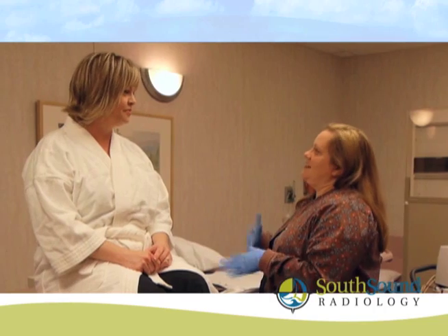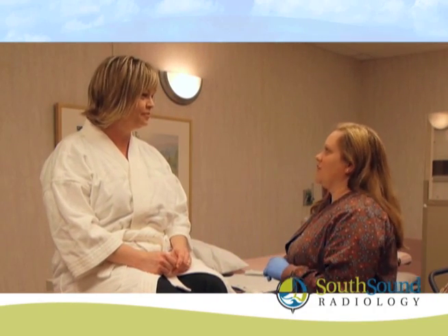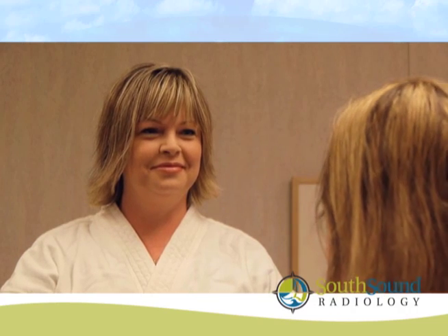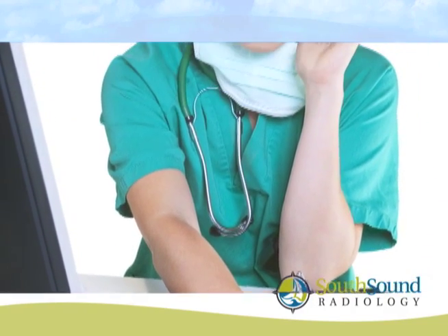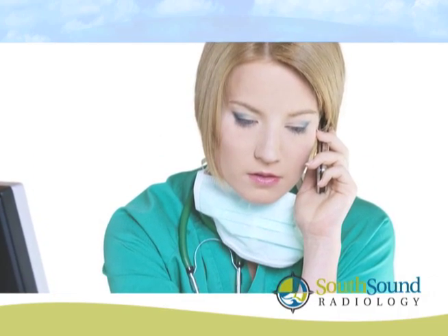As the patient, you are our priority. If there is anything that we can do to make you more comfortable before or during the procedure, please let one of our staff members know. A staff member will contact you the next business day after your exam to inquire how you are doing and answer any additional questions you may have.